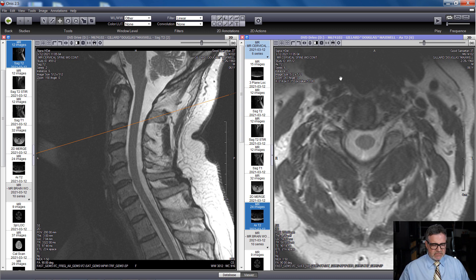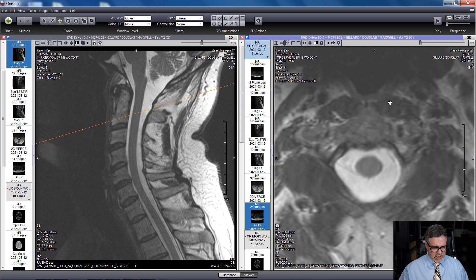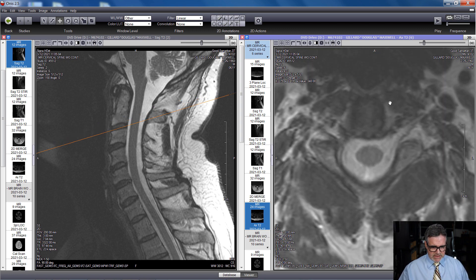Sure enough — there's the body of C2, the anterior thecal sac cerebrospinal fluid, the spinal cord, posterior CSF, and the epidural fat. The cut missed the spinous process. Now let's go down and look at the C2 disc. These cuts aren't perfect — this is a quick hospital series, not a full 12-series study. It was just to make sure I didn't have blood clots or anything compressing the spinal cord.